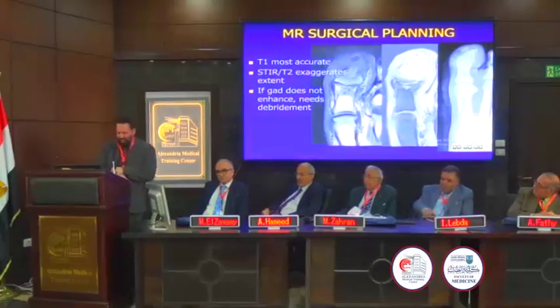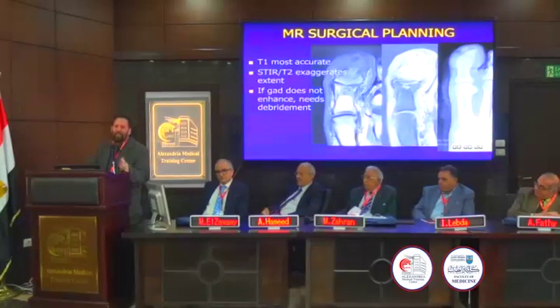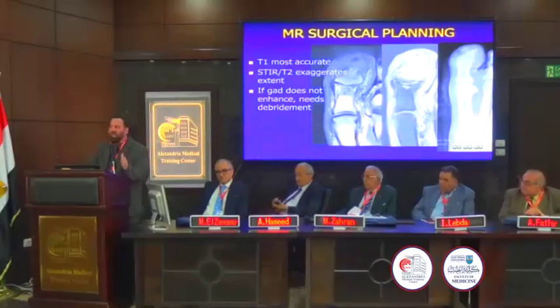Okay, surgical planning. Where do they amputate and when do they amputate? So if there's decreased enhancement, you need an amputation. If you're going to do an amputation, you amputate only the T1 weighted abnormality, not the T2, not the gadolinium. The T2 and the gadolinium will respond to intravenous antibiotics. So you only amputate what's abnormal, and again, first year resident abnormal on T1.